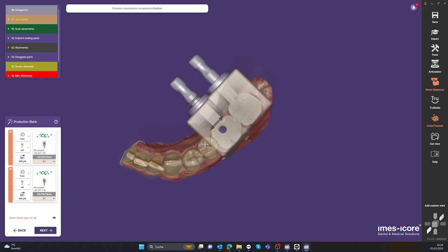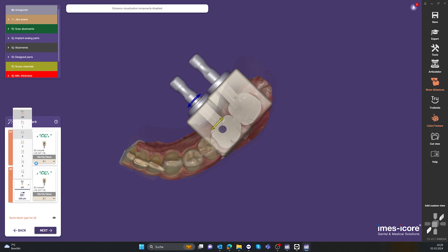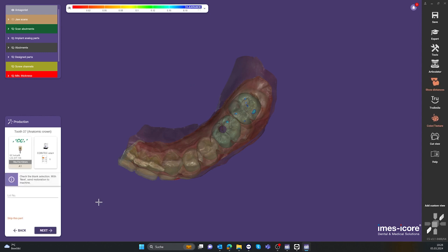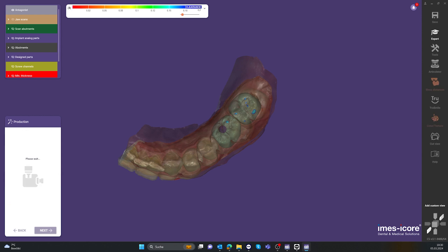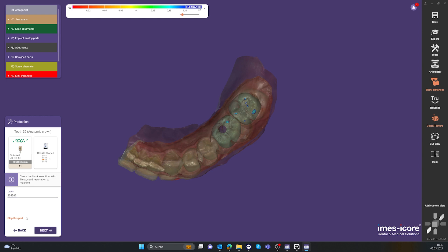In the next step, the milling file is calculated. When processing blocks instead of disks, no manual control of the CAM software is needed. Instead, the file is calculated automatically, reducing the error rate and speeding up the process. The CAM software creates a milling file that is transferred to the machine to start the milling process.